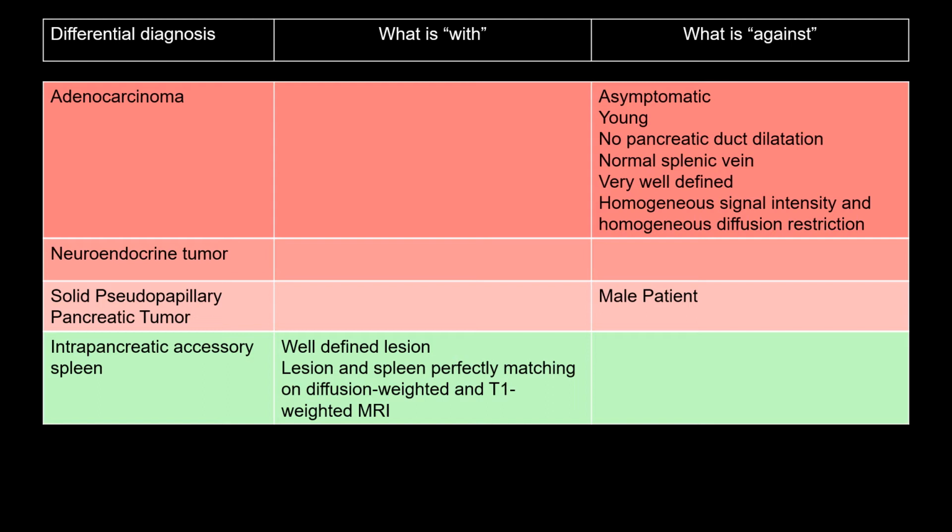On the other hand, the well definition of the lesion and the matching signal intensity and diffusion restriction are features suggestive of intrapancreatic accessory spleen.